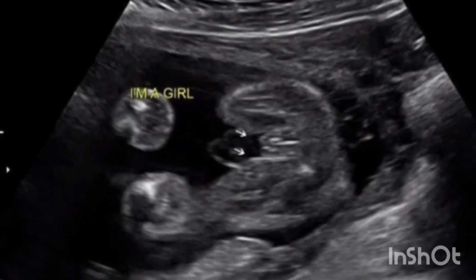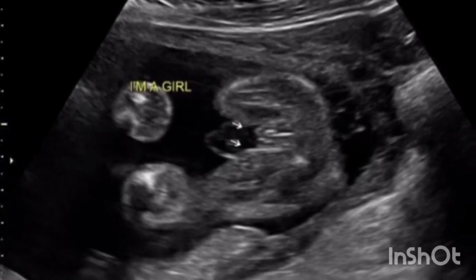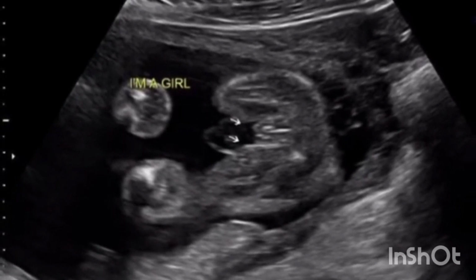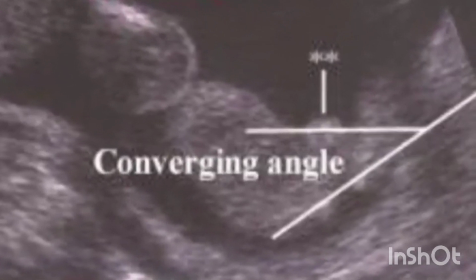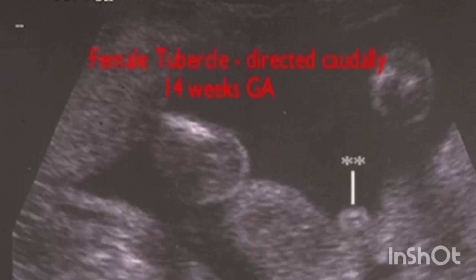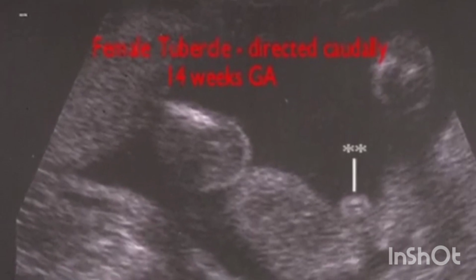If you look closely at the image, you will see that the labia lips would look similar to a hamburger bun, while the clitoris would resemble the hamburger patty. Sagittal sign. Each sex has a sagittal sign. It is obtained by looking at a profile view of the fetus, known as the midline sagittal plane.